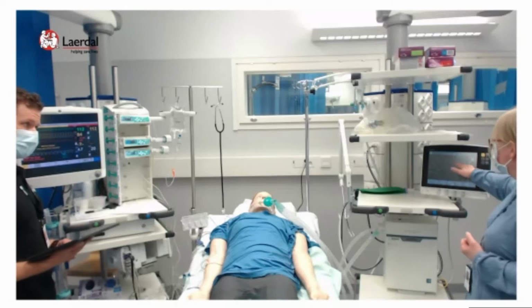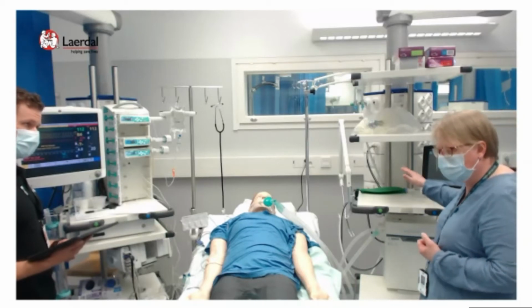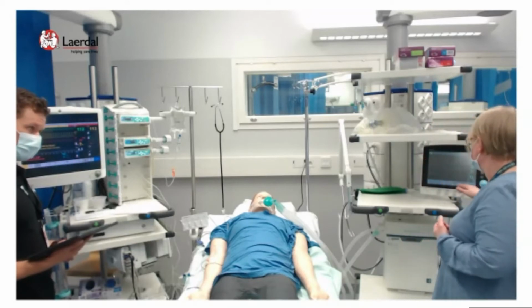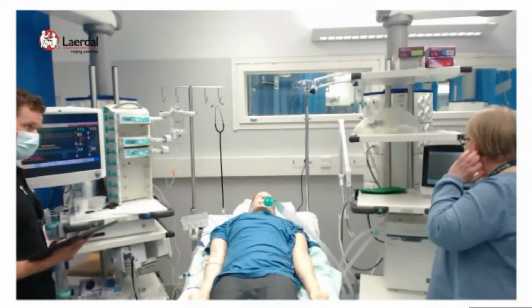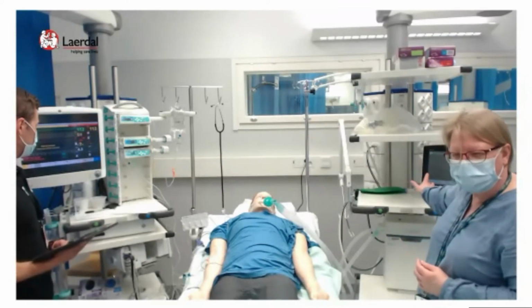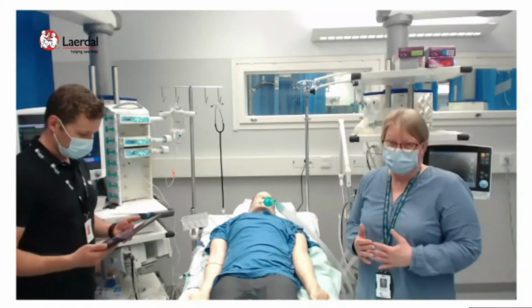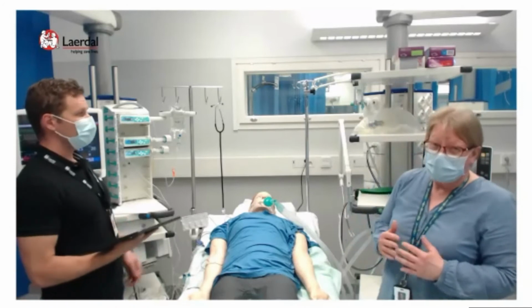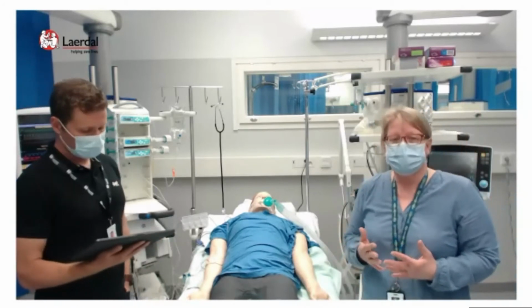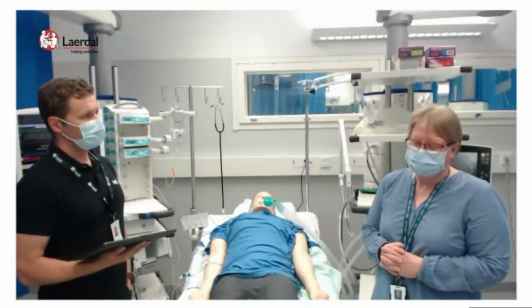We are on the volume control mode with SIMV, so synchronized intermittent mandatory ventilation. And the peak pressure is going up to 35 now in our simulation. So the plateau pressure is also getting very high, and you might remember that the recommended plateau pressure should be around 28 and not exceed 30.